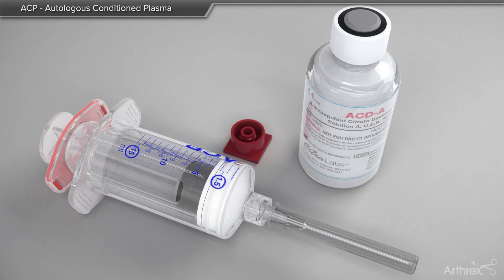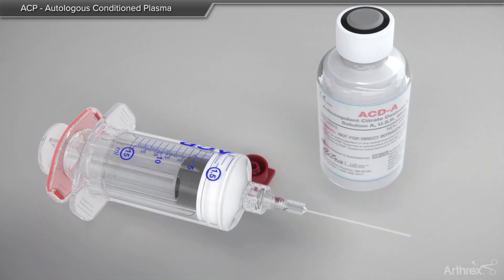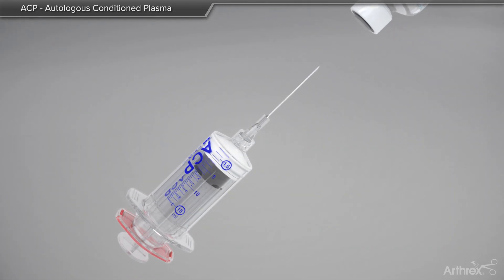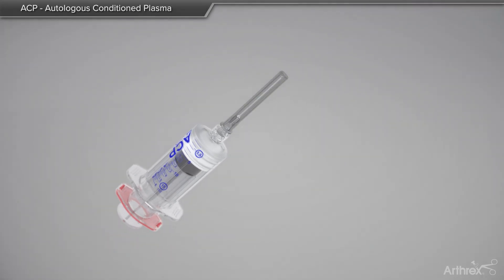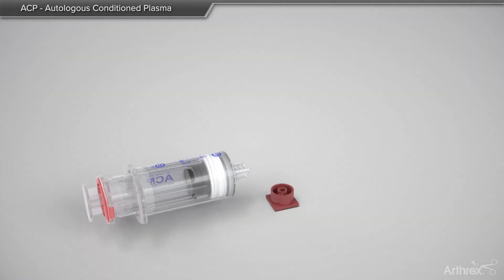The process begins by adding anticoagulant, referred to as ACDA, to the double syringe system. The outer portion of the syringe is pulled back to withdraw the ACDA. If the plasma is going to be used within 30 minutes of the blood withdrawal, the ACDA is not required.